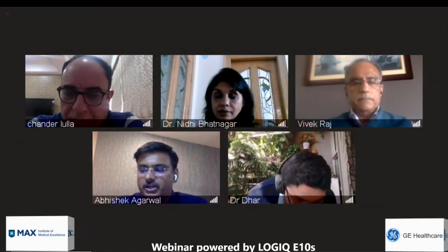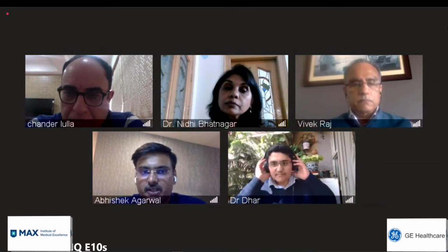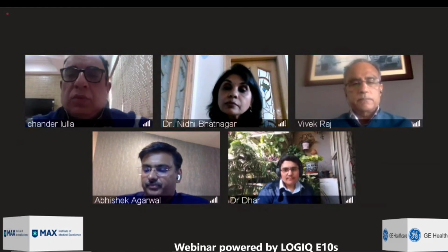So as far as the radiologist goes, if a patient comes to me for an elastogram and I see that the liver is frankly cirrhotic, I do still go ahead and do the elastogram, not send the patient back, right? Because a baseline value is always important to have. It is, yeah. Very good.